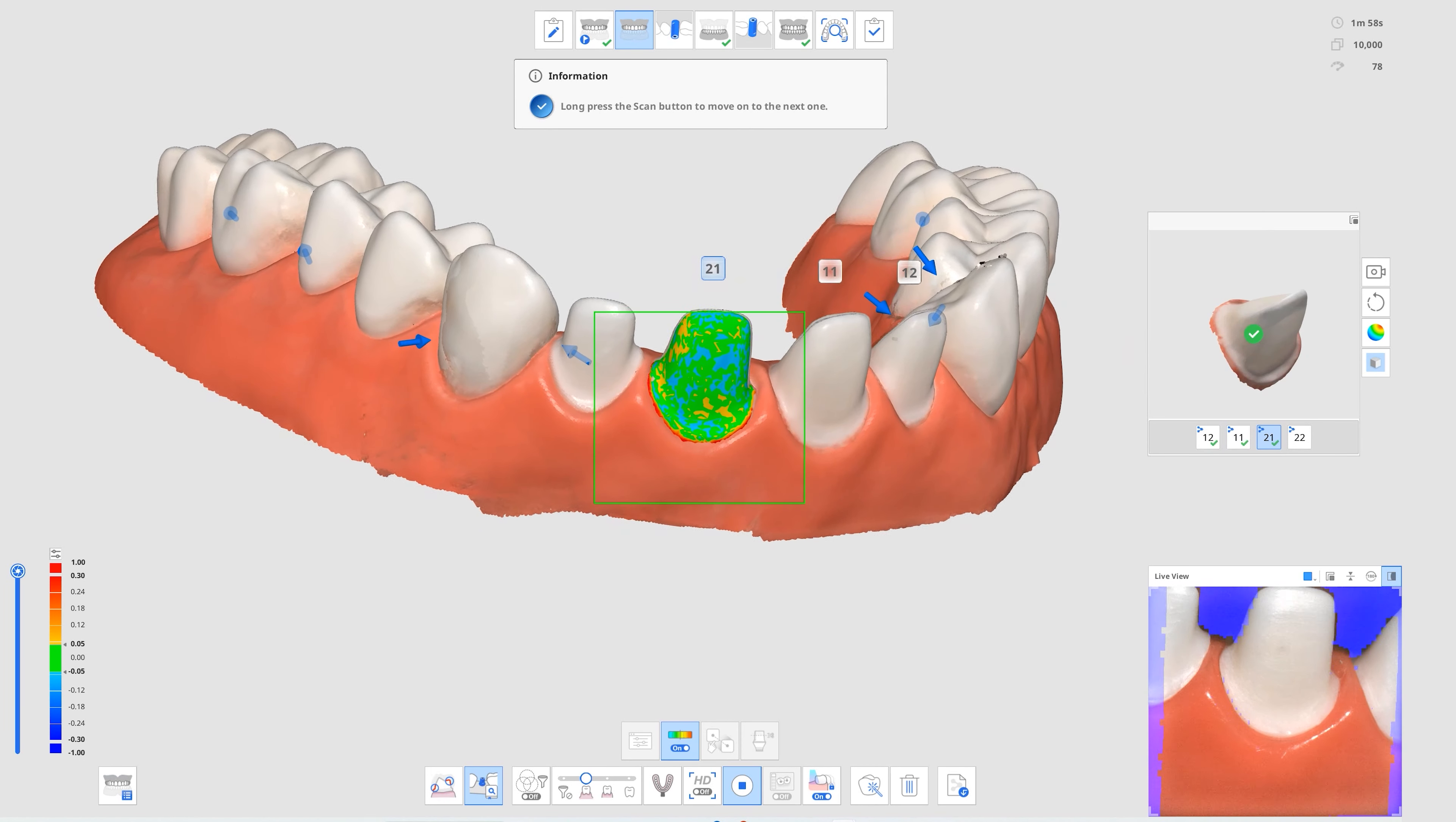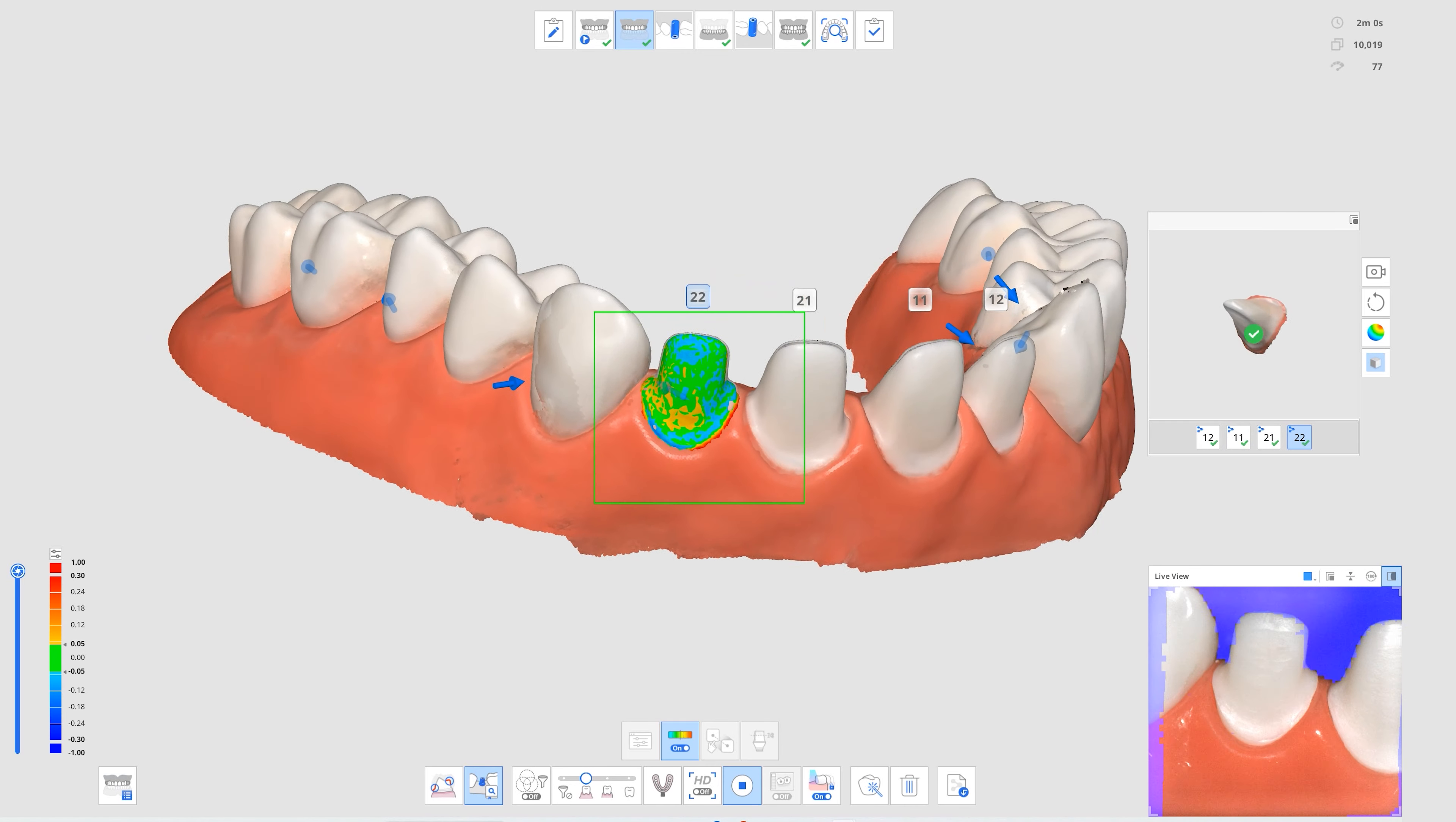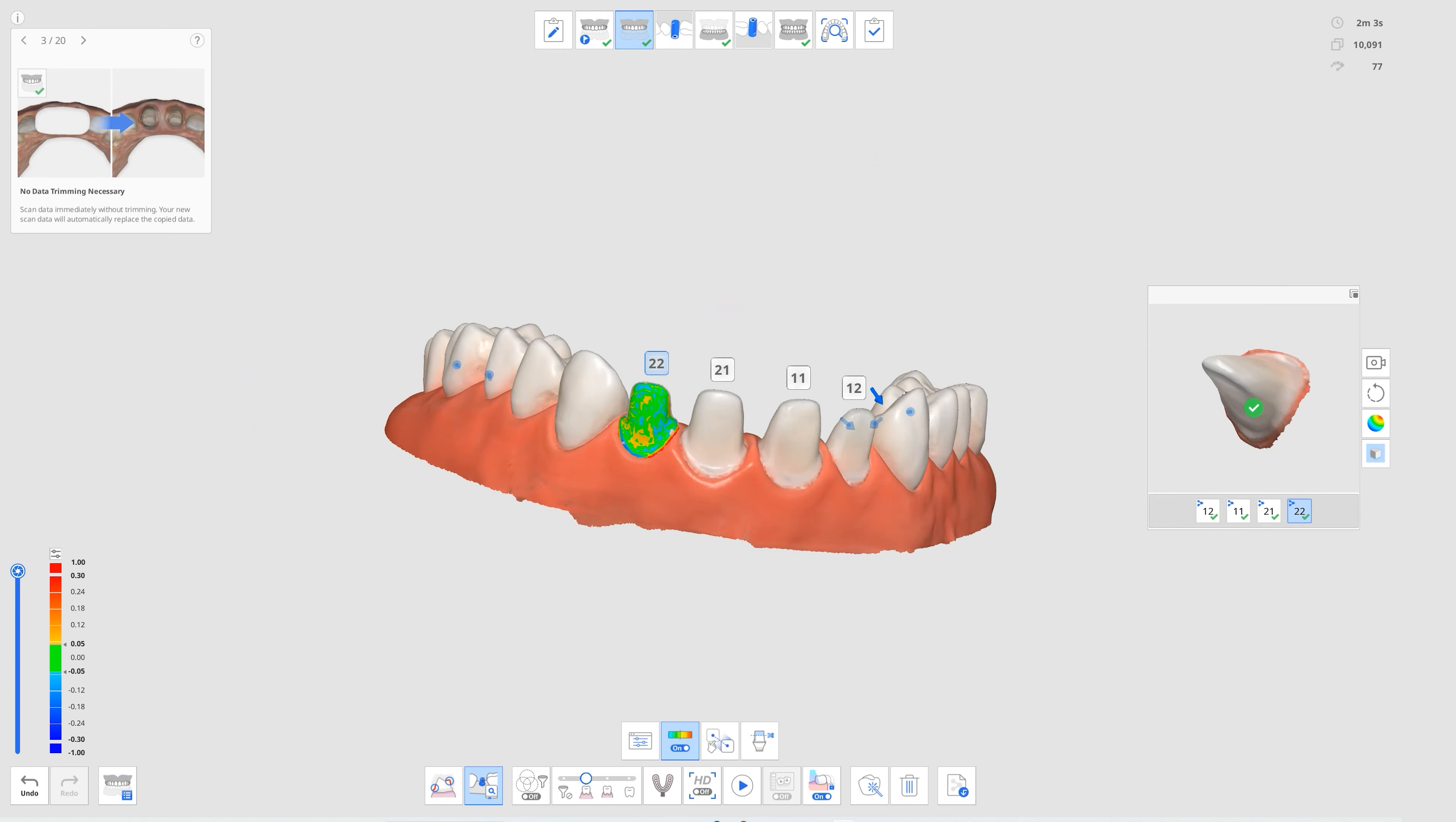With adjacent abutments or scan bodies, you can separately scan and align them in different data groups.